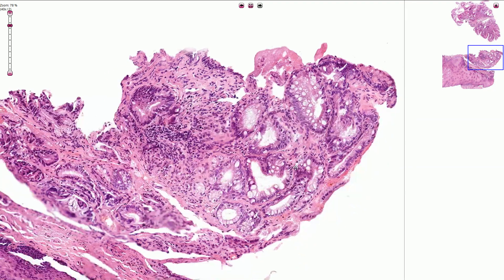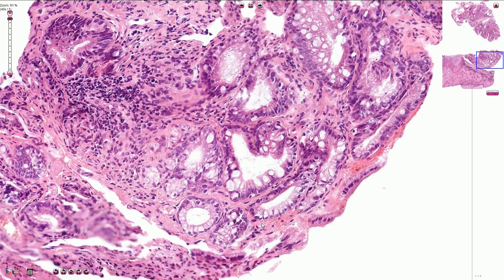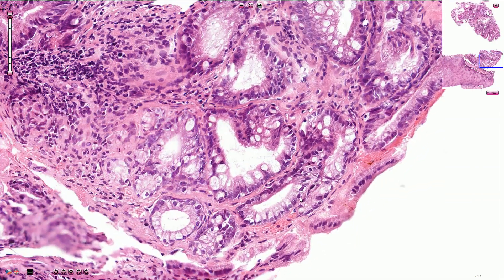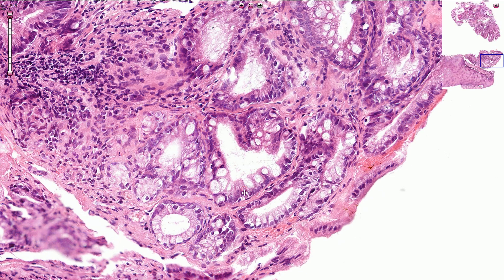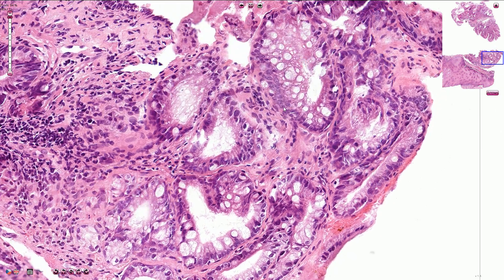In normal non-dysplastic glands, the nuclei should be basally located. We shouldn't see any hyperchromasia of the nuclei, even though reactive changes can be present. Prominent nucleoli can be found in cases of reactive changes.